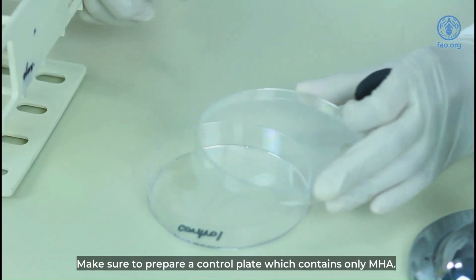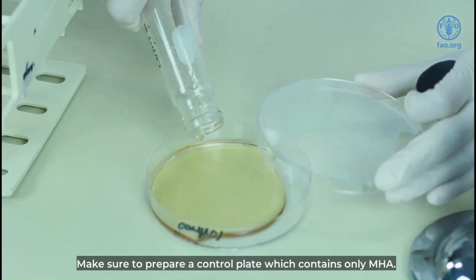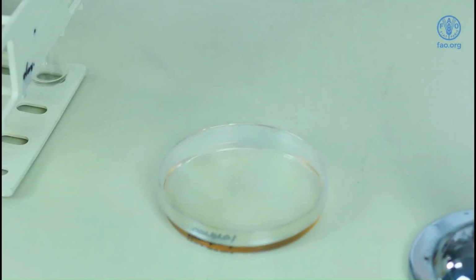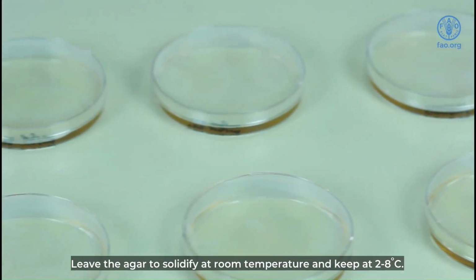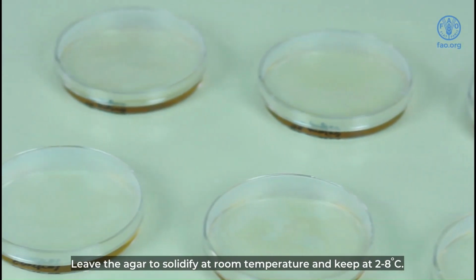Make sure to prepare a control plate which contains only MHA. Leave the agar to solidify at room temperature and keep at 2 to 8 degrees Celsius.